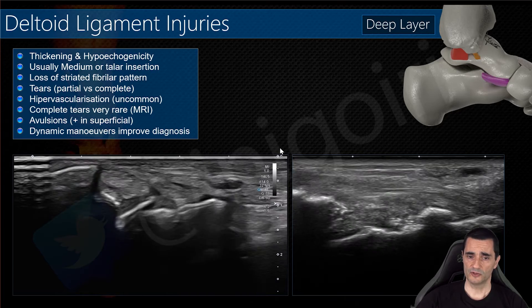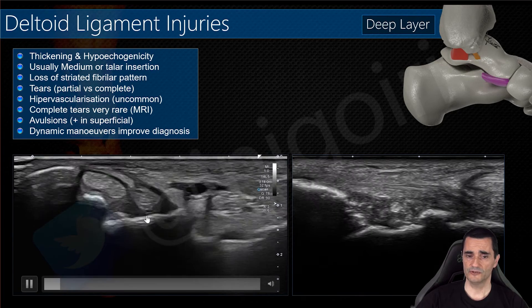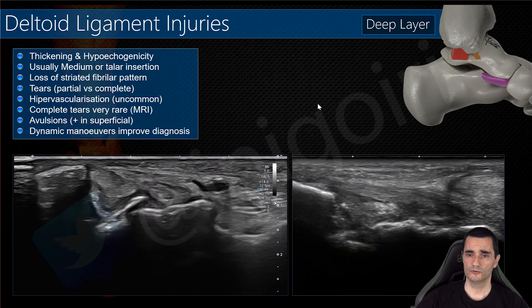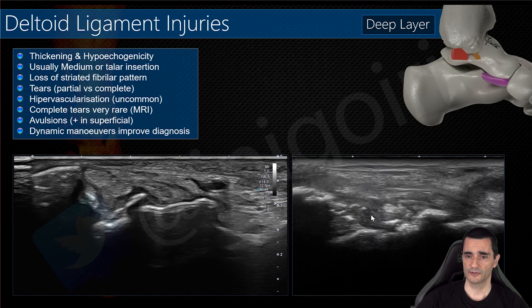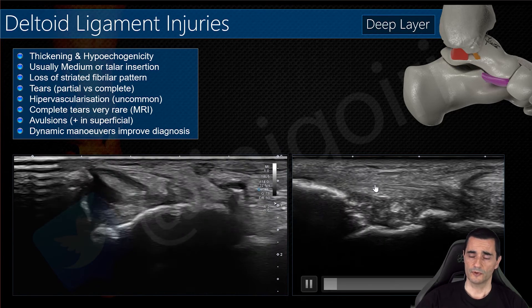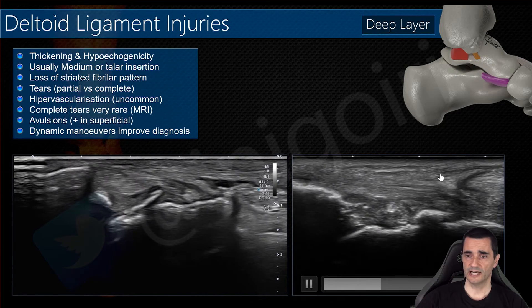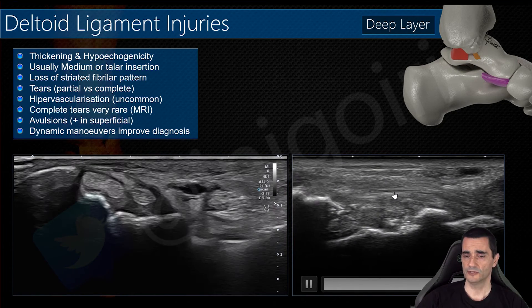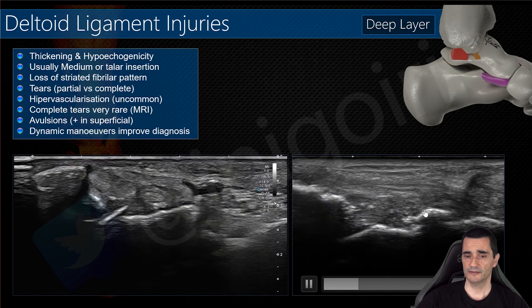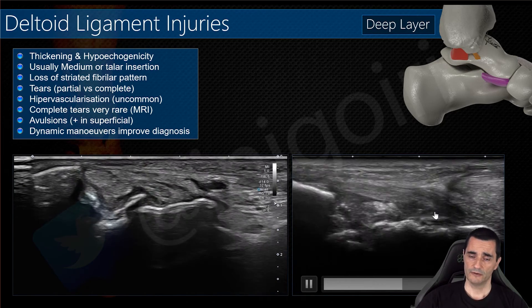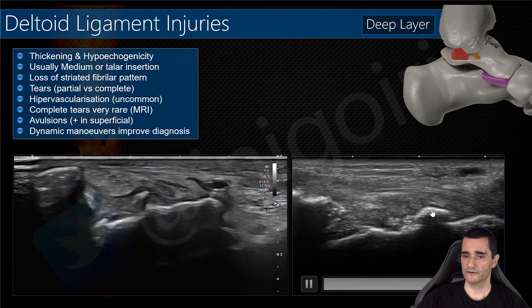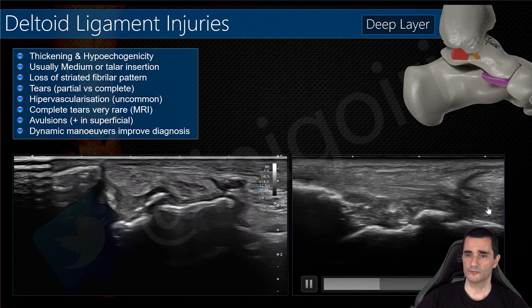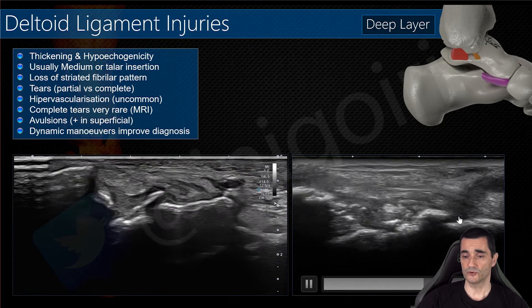Always perform dynamic maneuvers — for the posterior tibiotelar ligament it is mandatory to have a good view. You can also perform plantar flexion to assess the anterior components: the tibionavicular and tibiospring ligaments. Some valgus maneuvers can help us to distinguish tibio-calcaneal component injuries.